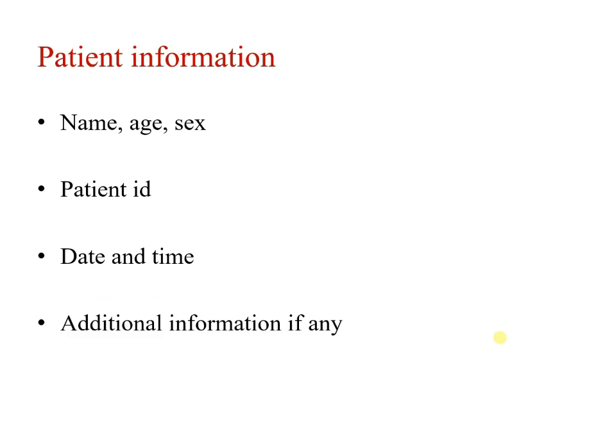The patient information I have already discussed in the consent form. It must contain the age, sex, name, address, and contact information of the patient. Then a patient ID must be assigned to every patient. Then the date and time of recording must be noted, and additional information if any.